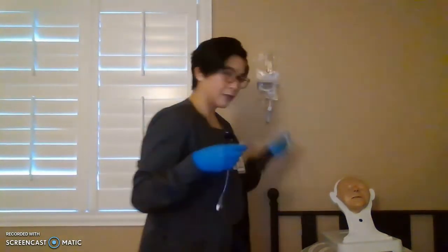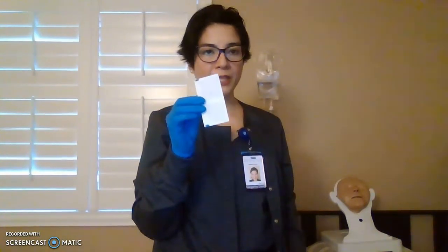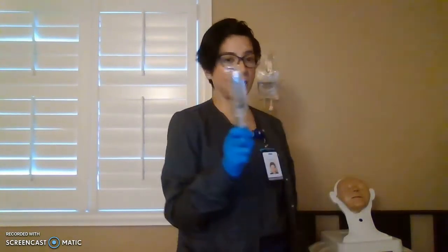Alright, so we fill off right here. Turn it off. Tap it. Why? Because at this point, you still need to clean your patient's hub. Do not forget, before attaching, clean it 15 seconds, let it dry, and then flush your patient's line, IV site. So after that, you can now connect it to your patient.